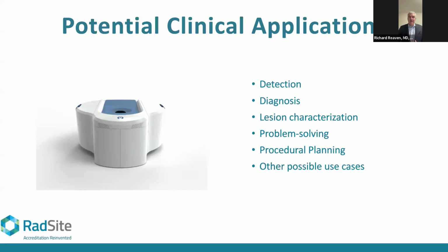The sensitivity for cone beam breast CT was 92%. So obviously a lot better. We're able to find a lot more cancers that we know are there with this technology compared to traditional mammography. And we have other studies that can corroborate these findings.